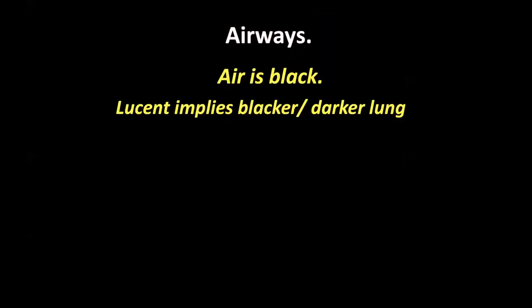Air is black, and lucent implies a darker lung. Once you've looked at the technical factors and cardiothoracic ratio, the next thing to look at is what you expect to be black. We're all trained to look at an X-ray and immediately go 'oh, it's white there — there must be consolidation, a pleural effusion, a mass.' We tend not to look at the part that is most obvious, which is the air — the black parts.